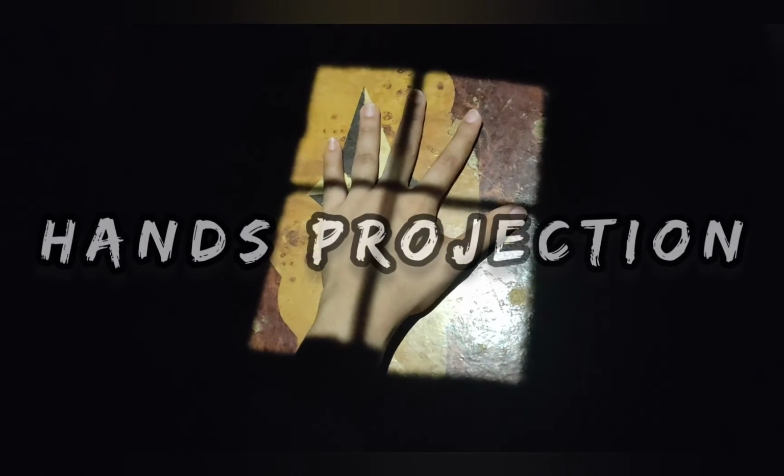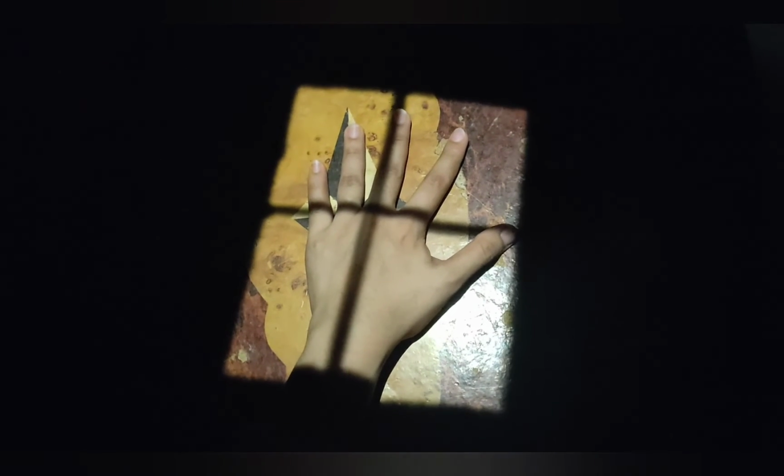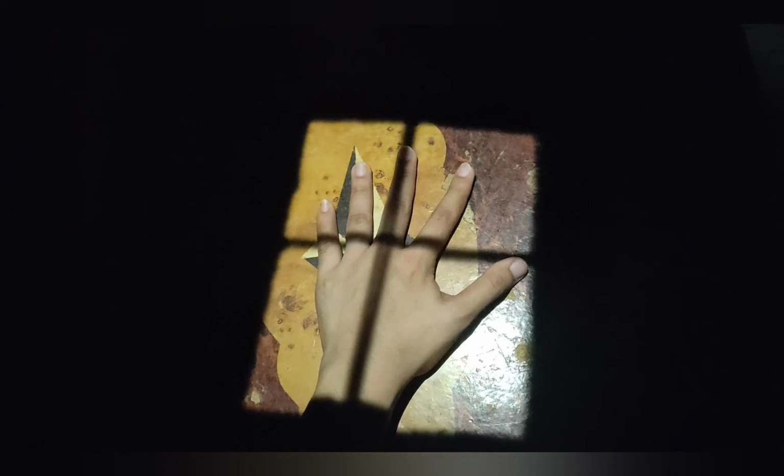For hand projection, we have the PA projection, the PA oblique projection, and the lateral projection. So this one is the PA projection. Patient position: sit the patient at the end of the table with the elbow flexed about 90 degrees and the hand and forearm resting on the table. Part position: pronate the hand with the palm surface in contact with the IR. Align the long axis of the hand and forearm with the long axis of the IR. Center the hand and wrist to the IR. So the CR is perpendicular to the IR, directed to the third MCP joint.